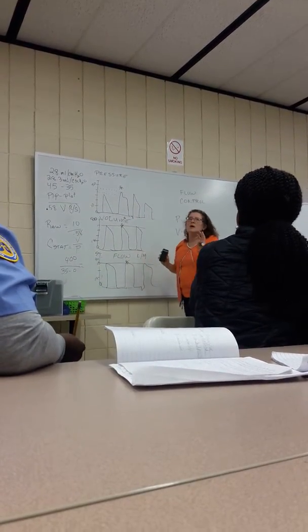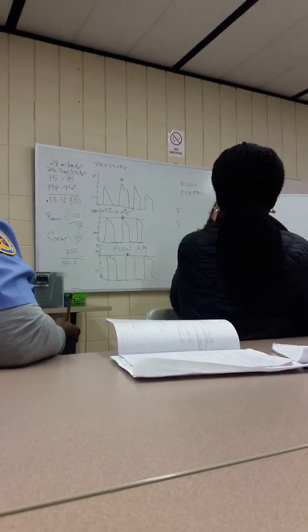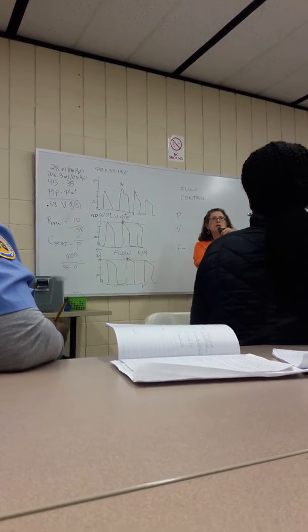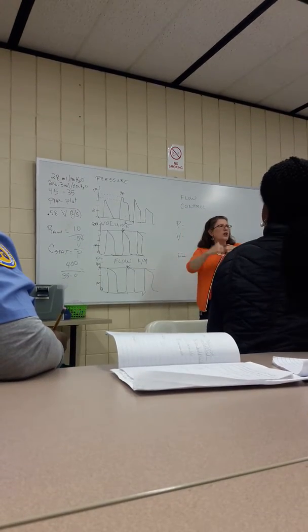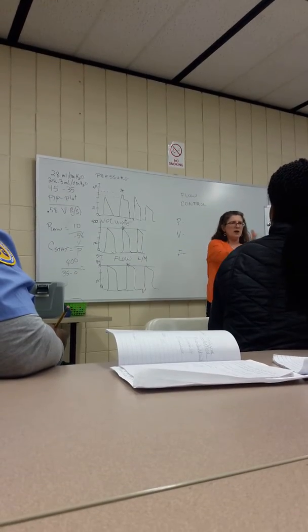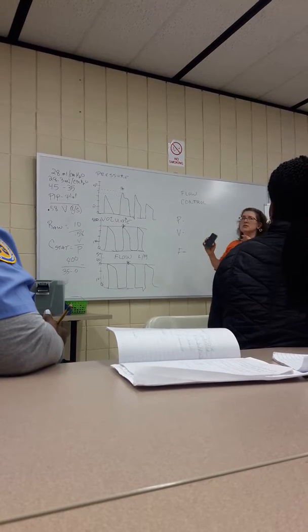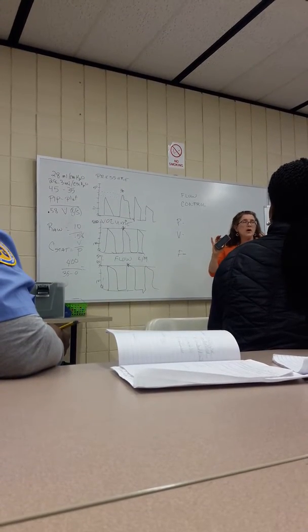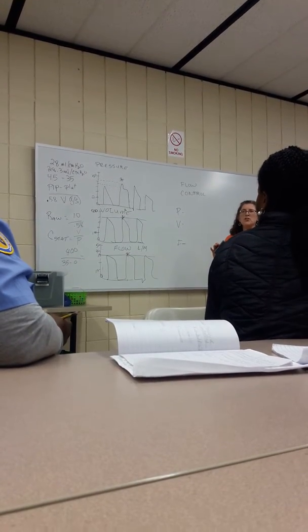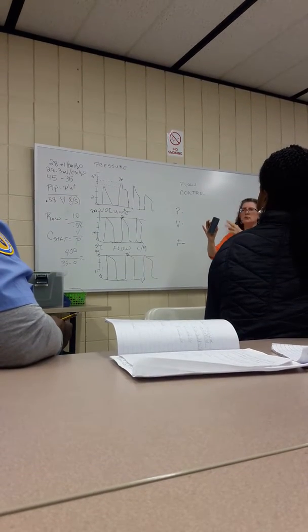Okay, the way current ICU ventilators work, there used to be a piston inside. There was a certain volume, so the piston expanded or contracted, a certain volume would go in, and then when the breath was triggered, it would push that volume of air out. Most vents are considered to be flow control, but for our purposes we're really setting a volume, so we're gonna call it volume control.